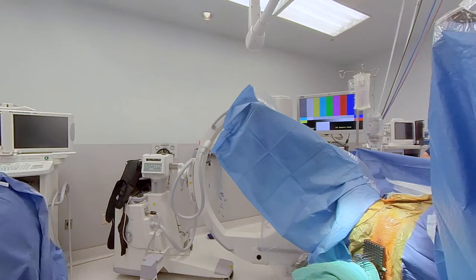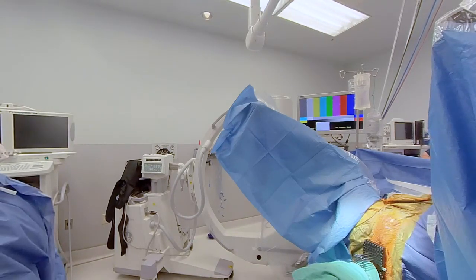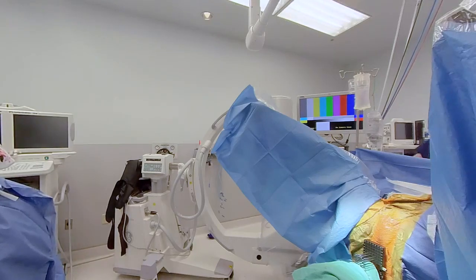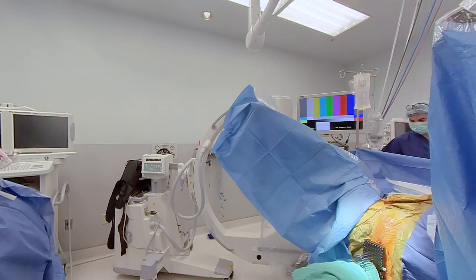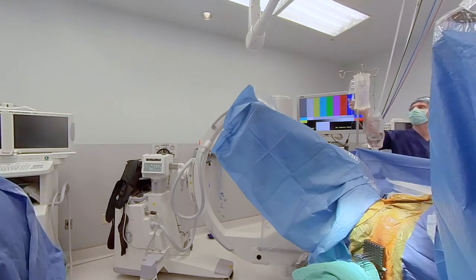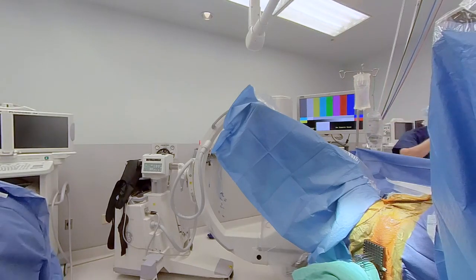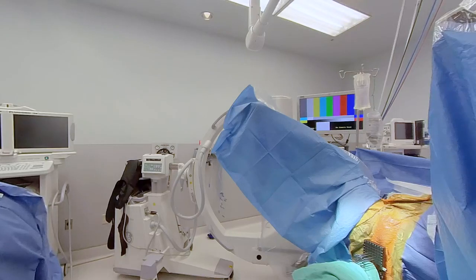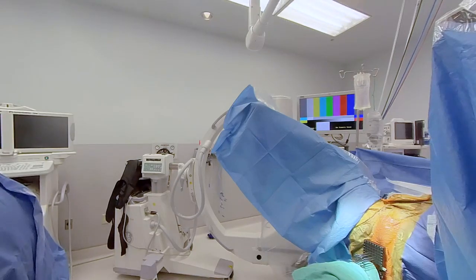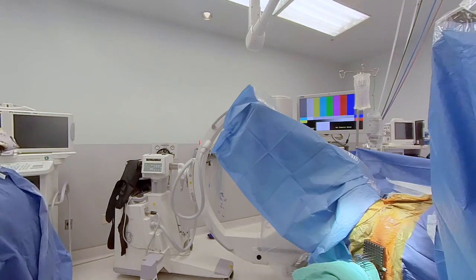And you can see the nice thing about this plan is you can do some dose painting, so that 150% of prescribed dose lands in regions where cancer normally sits in the prostate. If there's a dominant intraprostatic lesion that was identified, you can also hot load that. We know that there was a dominant lesion on the right side, so you can see that 150% of prescribed dose is within the DIL, the dominant intraprostatic lesion. So you can manipulate the dose through the planning to give it hot loading on the peripheral lateral zones, which is a nice feature.